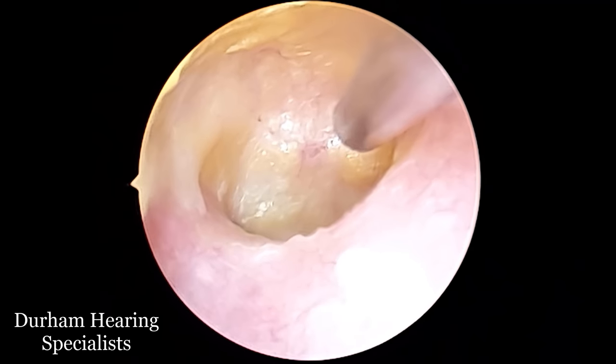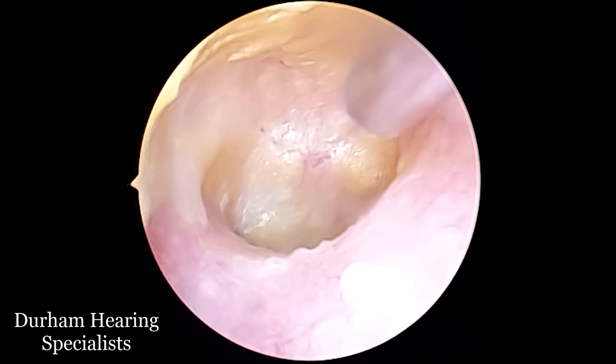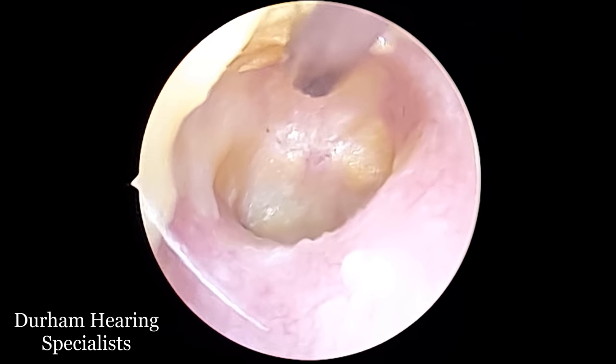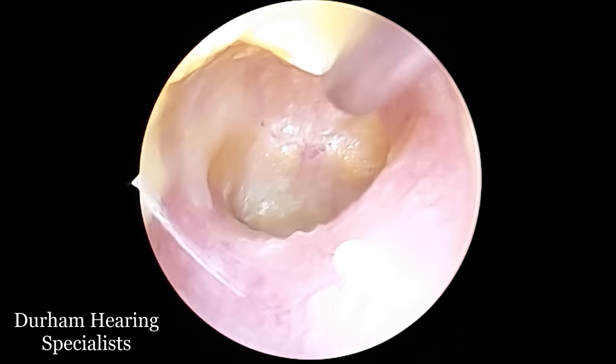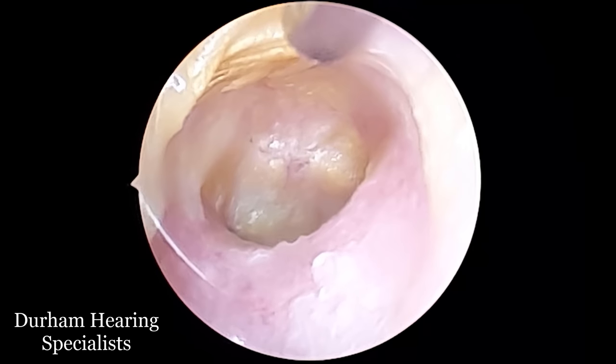Just to give you some context, I've seen this patient twice. The first time they came, the ear was just full of ordinary brown wax — no problem suctioning that out. And then I discovered this dead skin problem, and the skin wasn't quite ready to be peeled off.